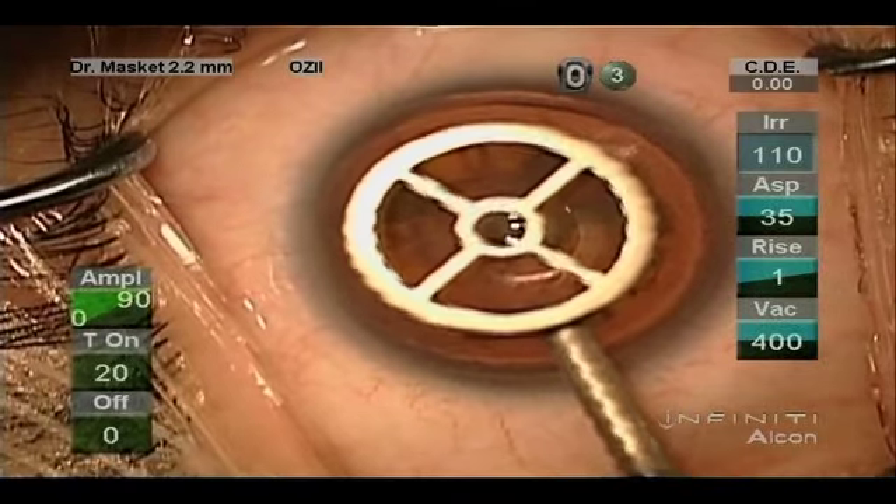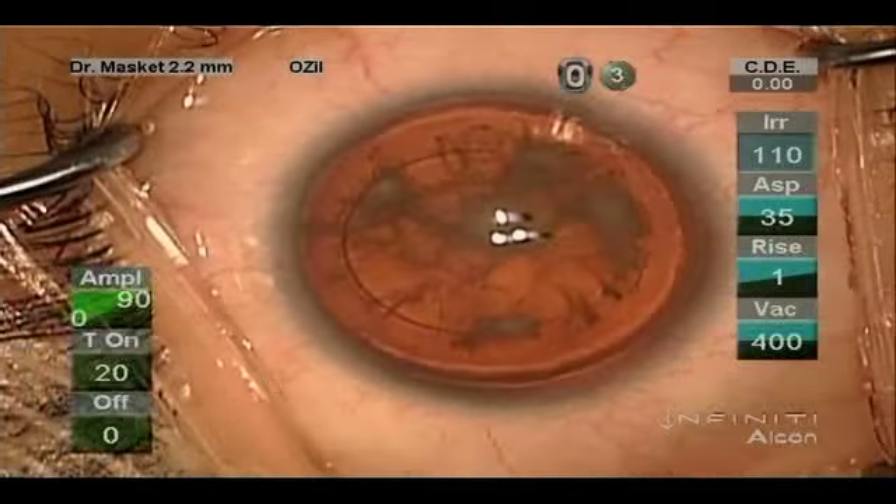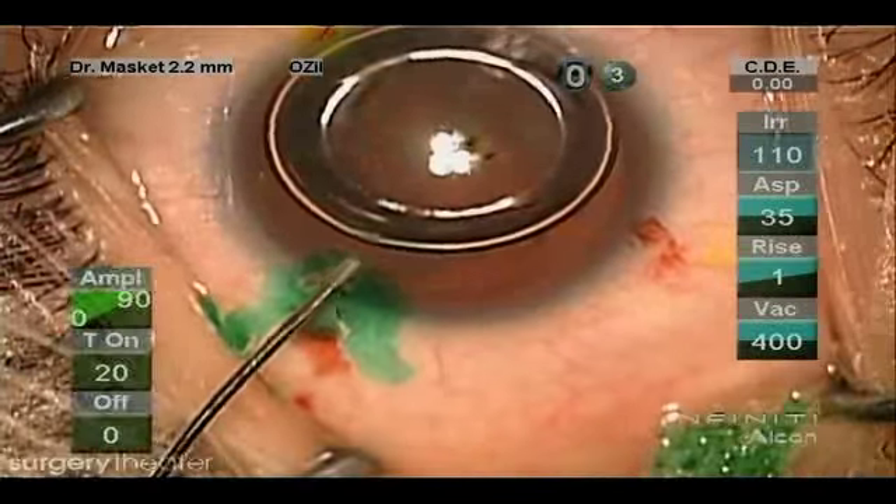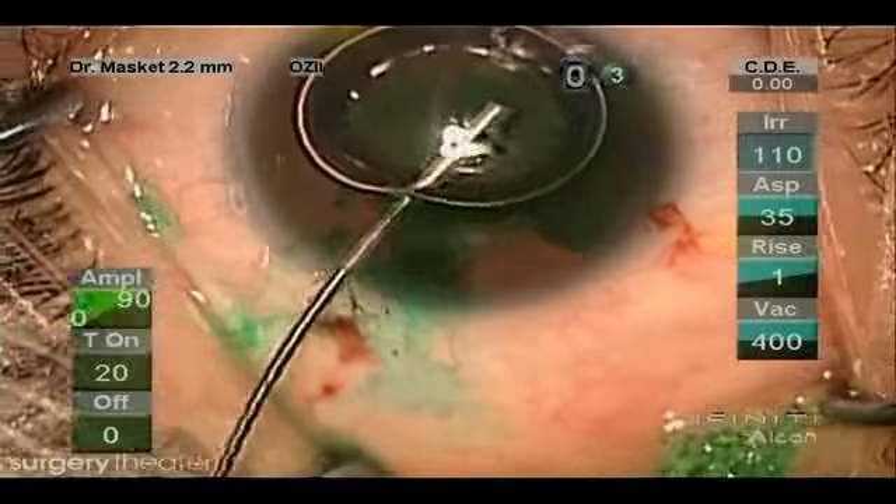This is the second eye of a 21-year-old with congenital aniridia, and we're marking the corneal apex to help guide us for the opening in the anterior capsule.